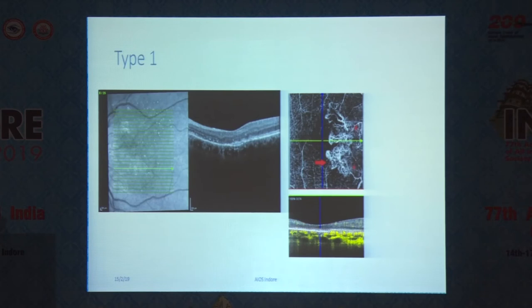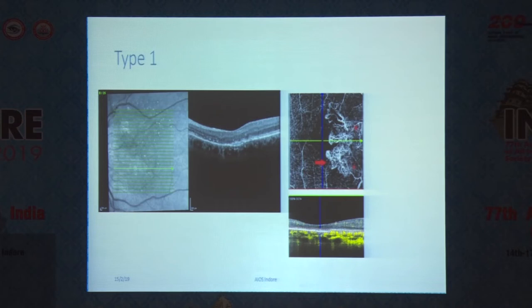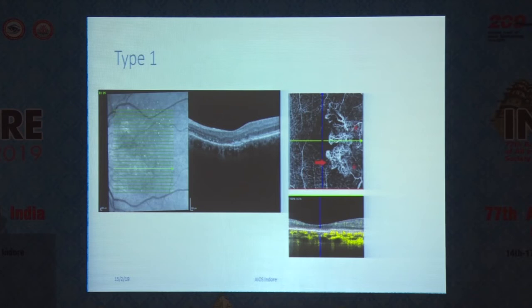I'm going to share a couple of cases using OCT angiography at diagnosis. The first is what we call type 1 CNV — the occult CNV, as it used to be called — which is sub-epithelial, outside the retina. The picture on your right shows the network seen in the deeper layer of the retina. The map below shows the yellow demarcation, which is the flow identified by the computing program. That is quite useful when you assess the OCT angiography images.